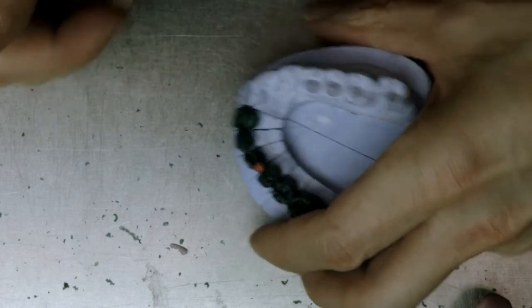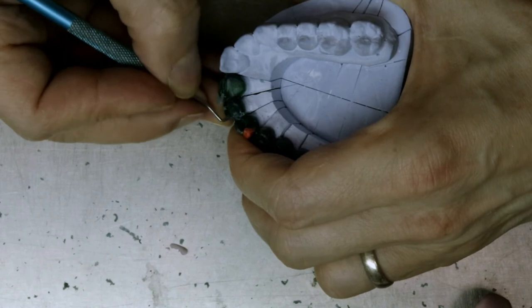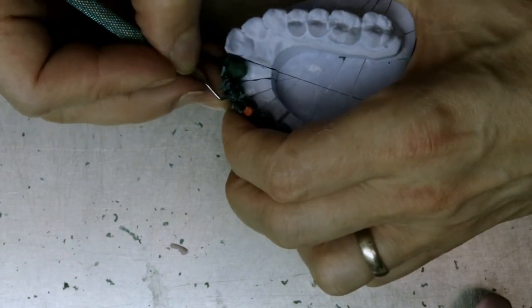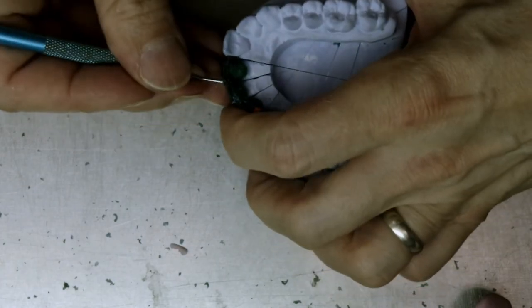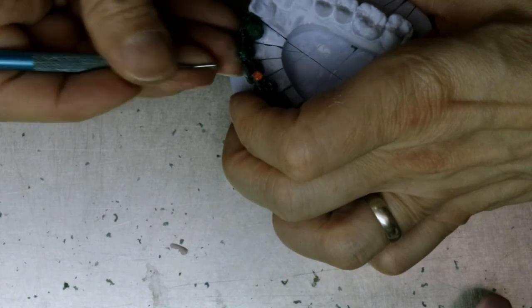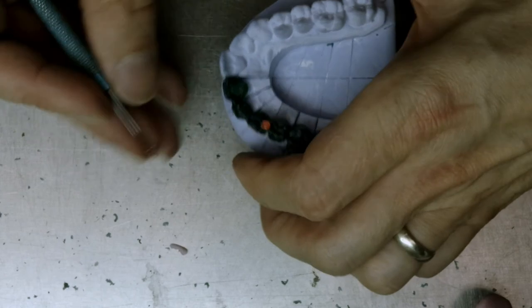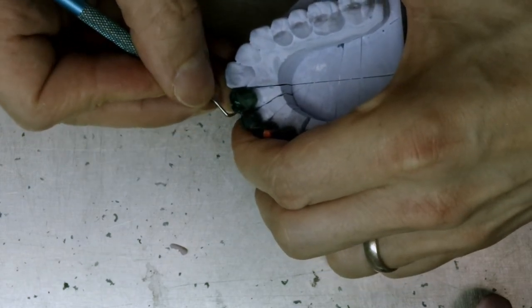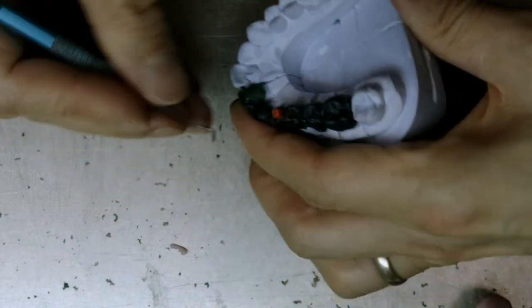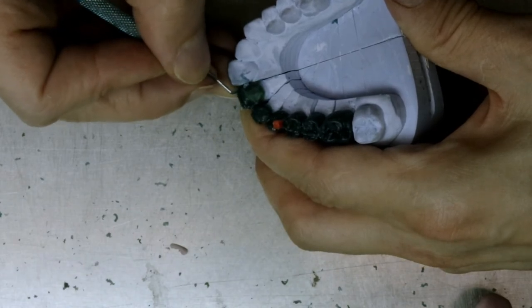After we cast it we can refine it even more. The lingual finish lines should go seamlessly into the proximal finish lines.